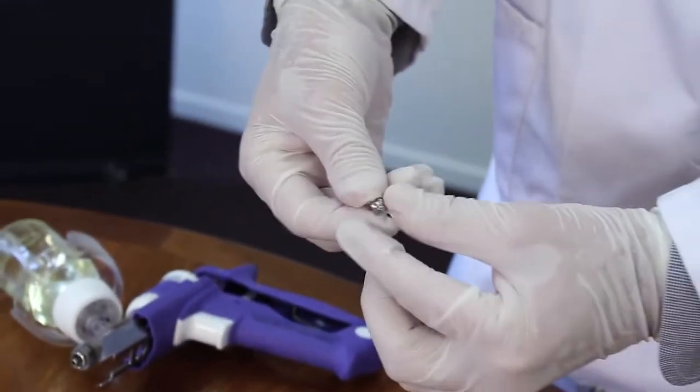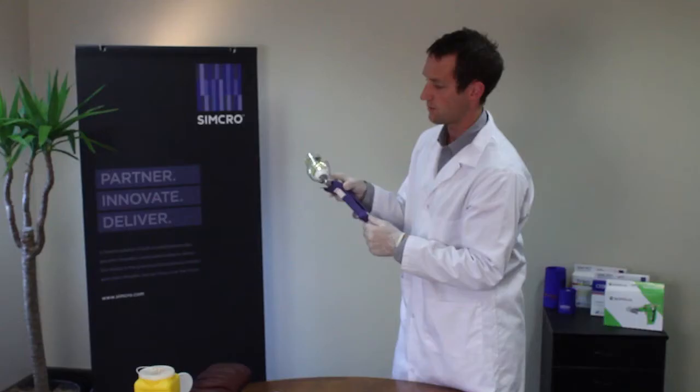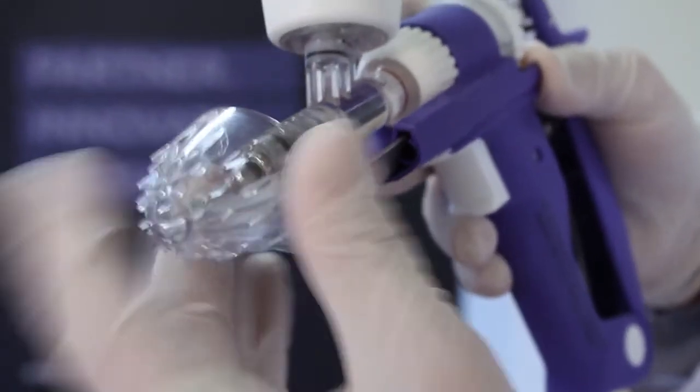We take our unsheathed needle, place it over the end, and using pliers or whatever you use, half twist that on. Then the needle guard clicks back into place.